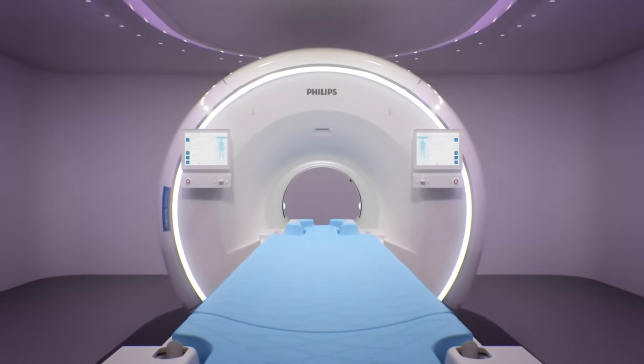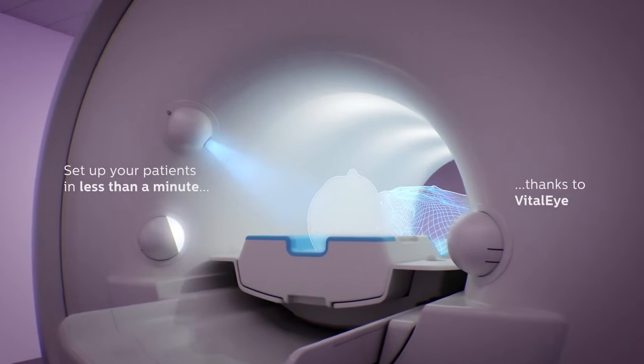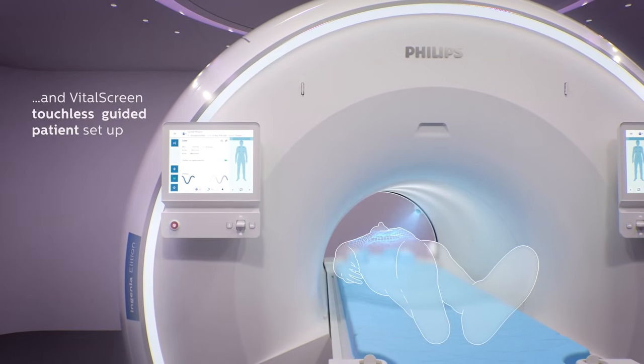Well, the beauty of that is essentially most 3D scans cover the huge region that we're often covering, especially on a wider patient. I think we're still finding our way with compressed sense in the sequence. If I was to look at the biggest impact that this sequence has on patients, it's often getting an answer to something that they've been searching for a long time.